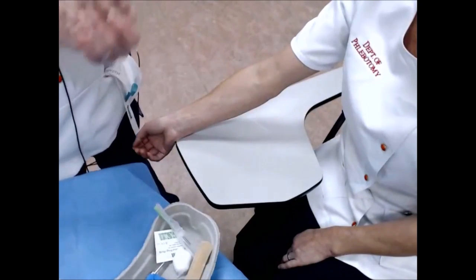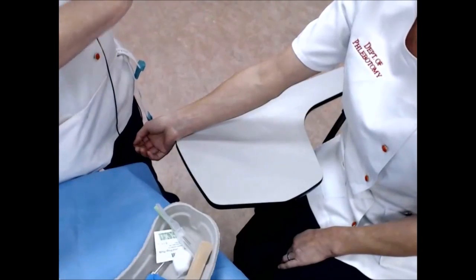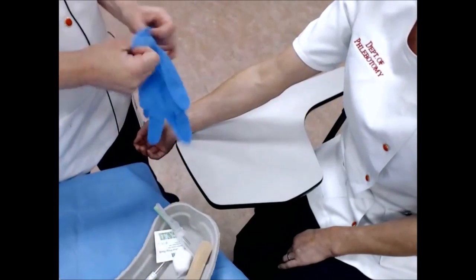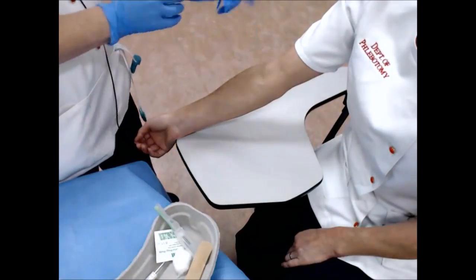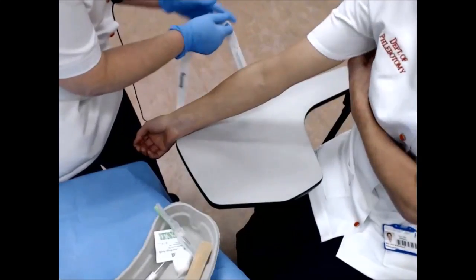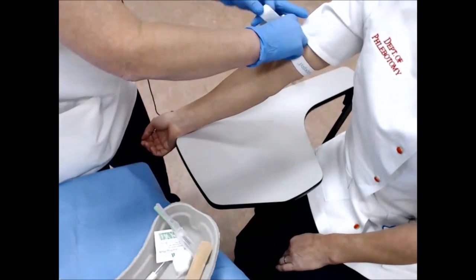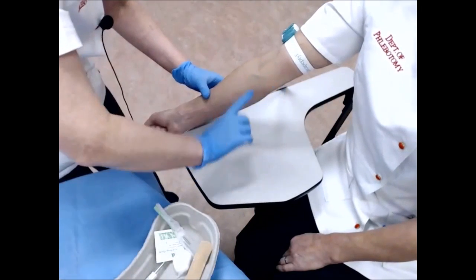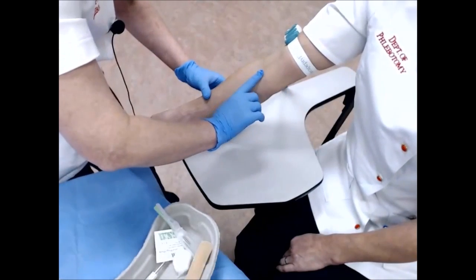I use some alcohol to cleanse my hands and put my gloves on. I position the patient's arm so that it's nice and straight, apply my tourniquet, and ask the patient to make a fist. I then palpate the arm to determine which vein I find most suitable.